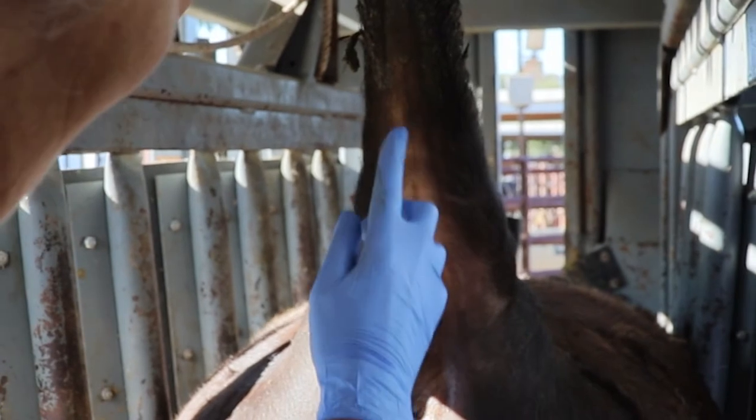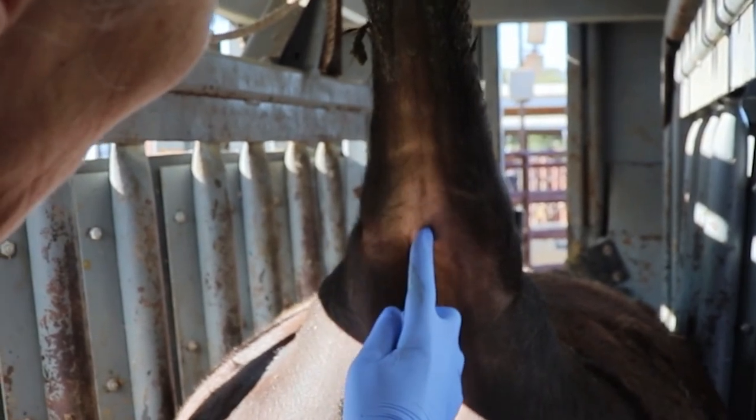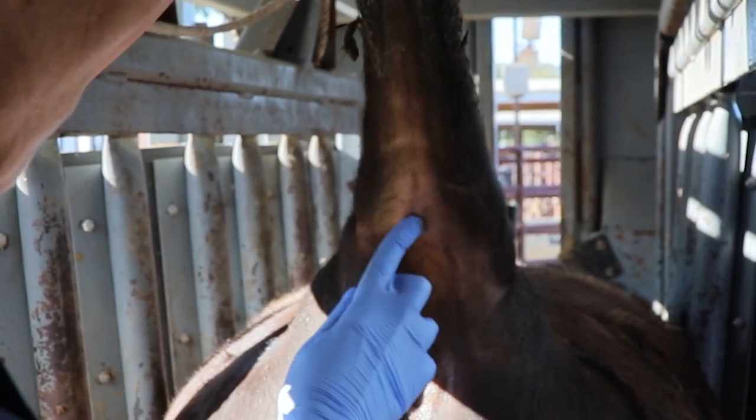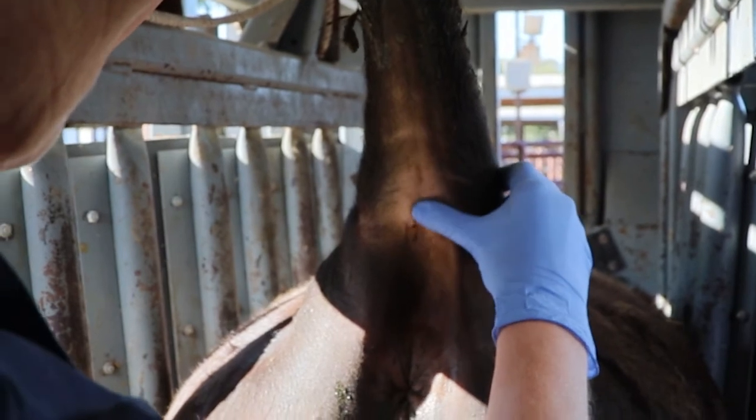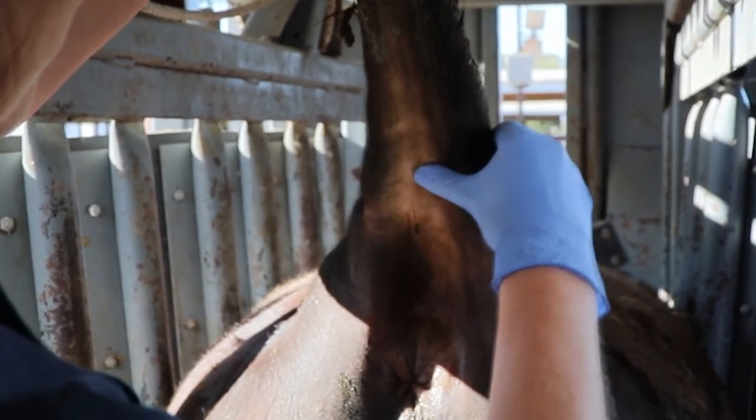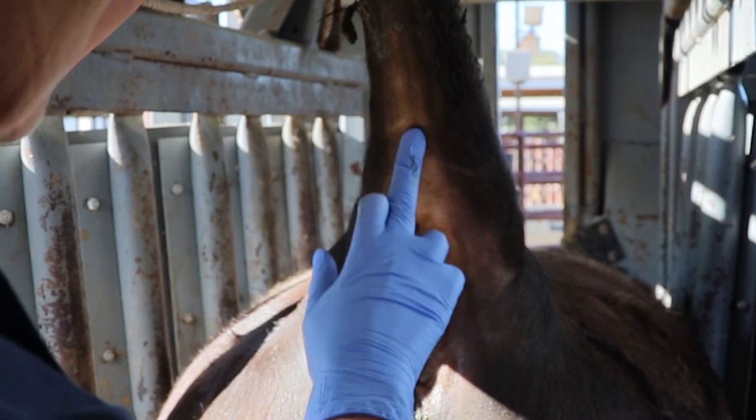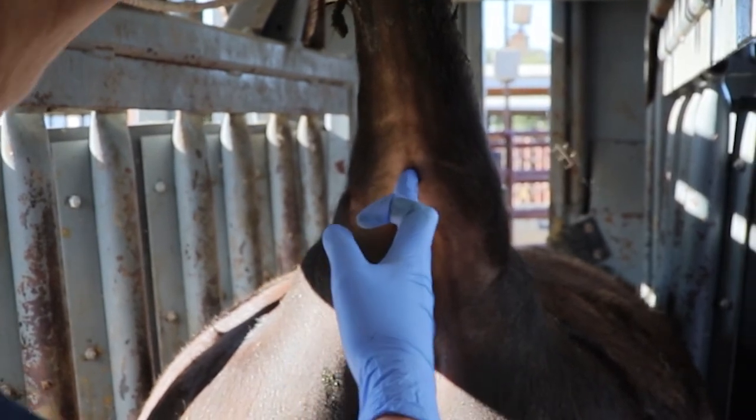There is a vein and artery that runs along the midline of the tail in this groove. There are vertebrae that you can feel and you want to avoid them with your needle. So this would be a good spot to go in.